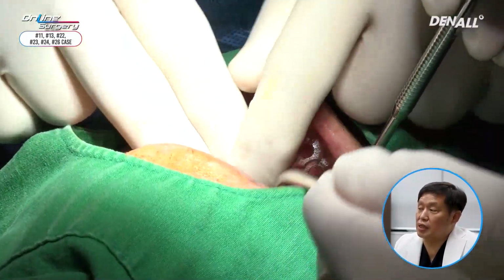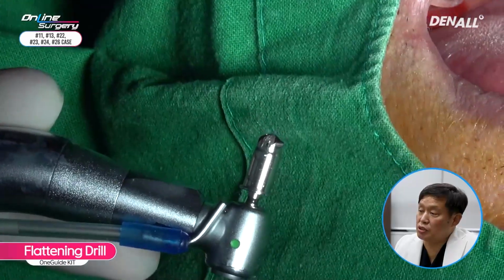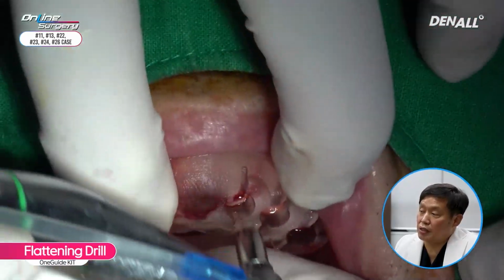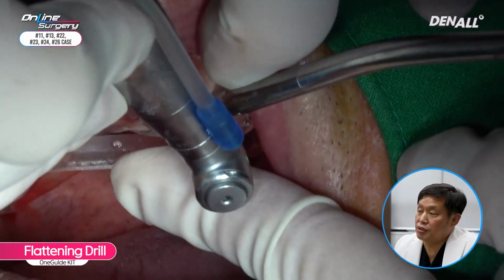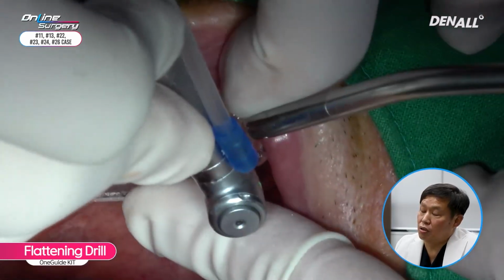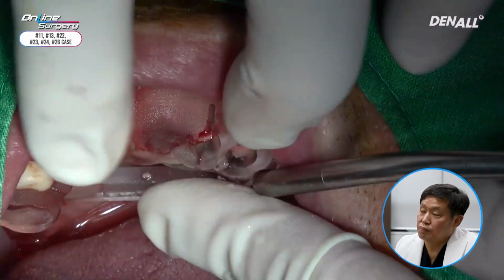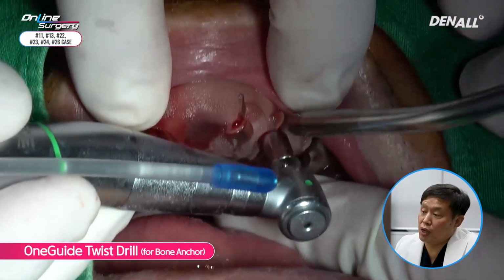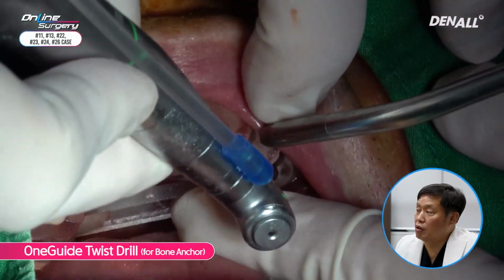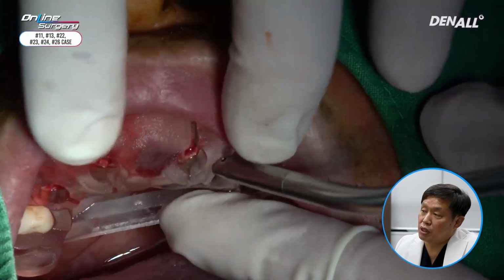Template was adapted once again. Vertical anchor will be used in number 23 first. I used the flattening drill first just to be sure. In number 23, flattening drill was used to full length. In number 23, twisted drill was used to place vertical anchors. Vertical anchors were fixated.